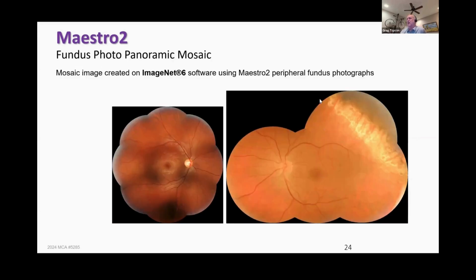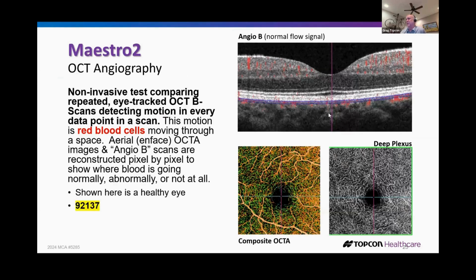And of course, fundus photography, old school, 9-field, peripheral imaging, all done semi-automatically. The camera literally tells the patient where to look, and it blends the images together after the fact. You can do upwards of 9 images all at once, which is pretty neat. Next slide. There's a detachment there on the right. Set this up. This is my favorite.